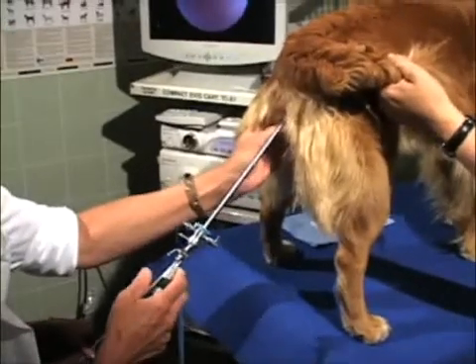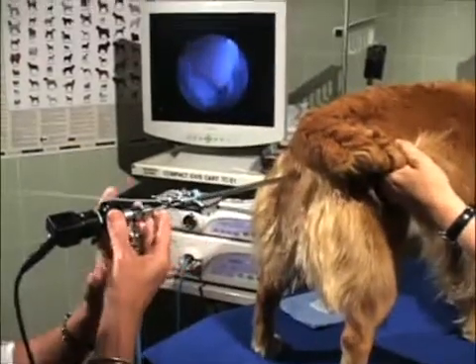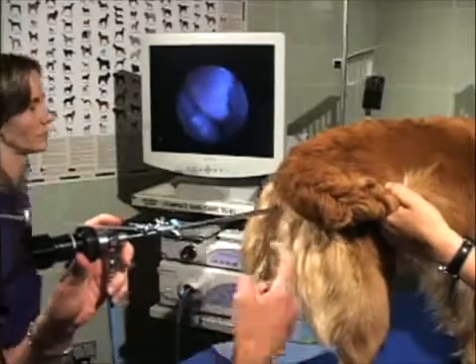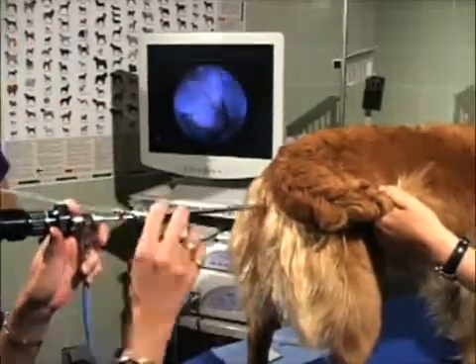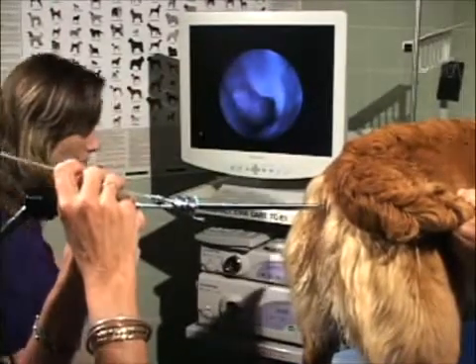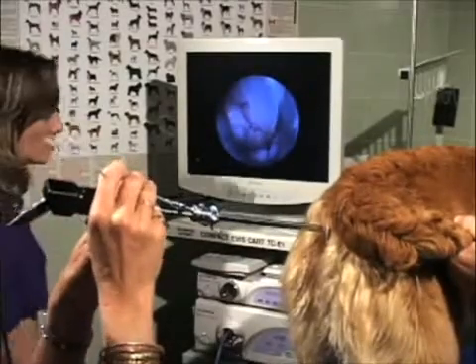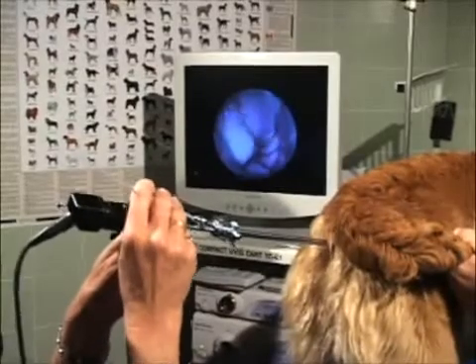The scope is directed dorsally in the vestibule until the actual vagina is entered. Generally, lubrication is applied to the sheath after the scope has been passed into the vagina, and not initially, to avoid interfering with the lens. Once the vaginal lumen is entered, the degree of crenulation can be evaluated, which correlates with the fertile period after ovulation.